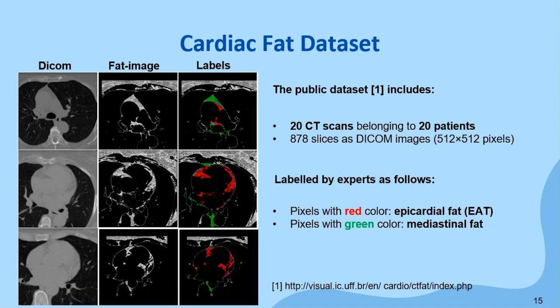It should be noted that this segmentation was done after converting the DICOM image into a specific range to highlight the fat, and we don't have the pericardium labels. It should also be noted that the DICOM images have different proportions and alignments than the images containing the labels, the ones manually segmented by experts, which we'll need to fix for the automatic segmentation of the pericardium.